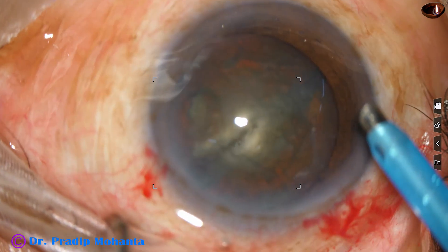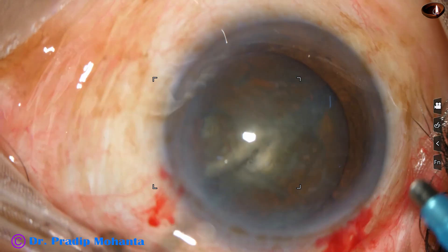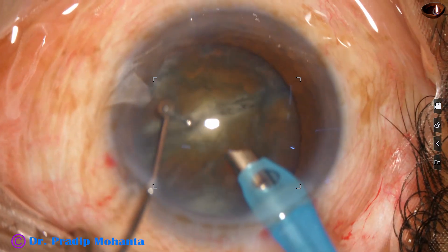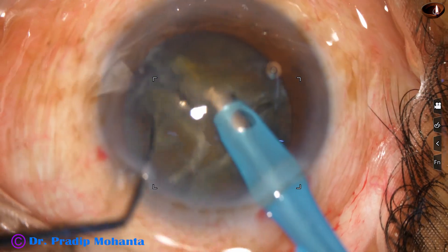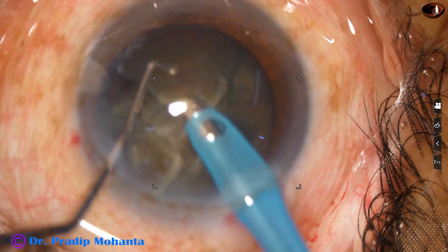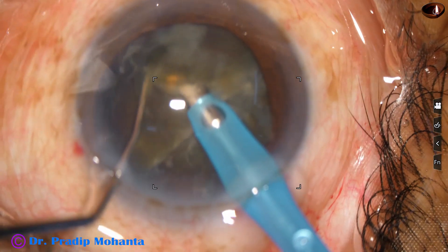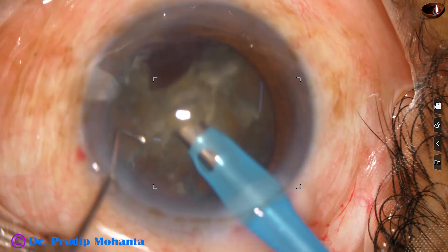So we have to manage this case somehow. I prepare to go into the anterior chamber with the phaco handpiece; the exposed part of the tip is about 1.5 millimeter. I try to hold one hemi nucleus and chop. I call this chopper the Nitto chopper — it is an instrument used in pre-chopping. The design is the same as Dr. Nitto's, but Dr. Nitto's chopper is about 2.25 millimeter and this is just 1.5 millimeter. I could divide the nucleus easily with this and emulsify the pieces.